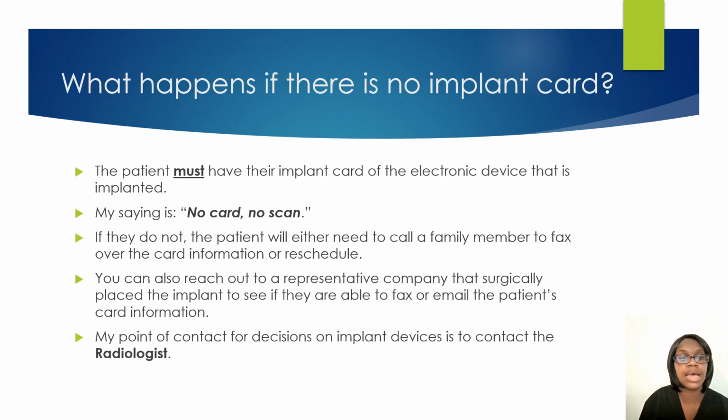If the patient does not have an implant card, they will need to reschedule. My saying that I always say: no card, no scan. Check with the radiologist to see if they would like to clear the patient. Most of the time, if the patient has an electronic implant with no card, the radiologist will say no. Check with your radiologist on if they can or cannot be cleared to do the MRI scan.